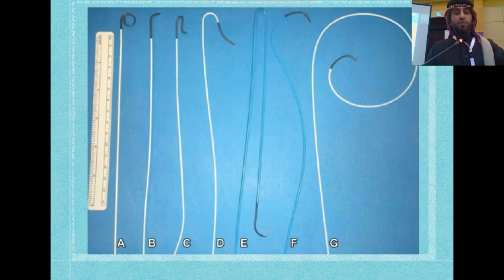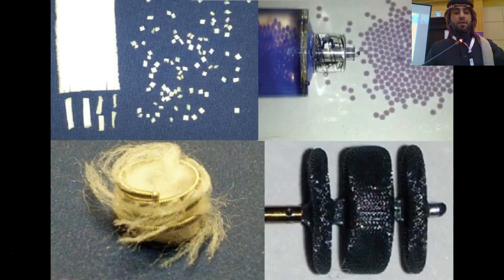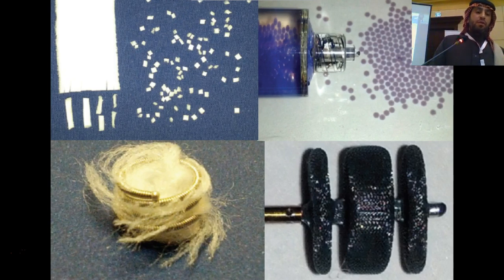So what are our tools? Sheaths, catheters, wires. This is just part of our daily practice, like catheters. This is 5 French. You could imagine that going into the artery. The embolic materials that we use range from permanent solutions like PVA, Embosphere, bead block, to temporary solutions like gel foam. If you use gel foam, recanalization will happen. It's a temporary occlusion, so there will be recanalization within 6 weeks. There are also plugs and coils that we sometimes use.